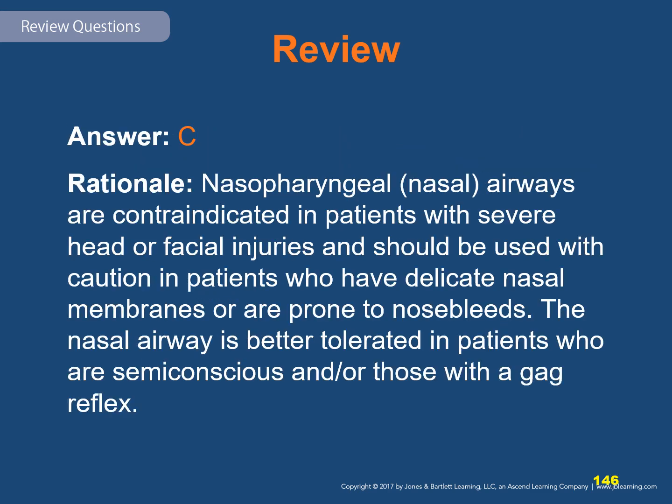The answer is C. Nasopharyngeal or nasal airways are contraindicated in patients with severe head or facial injuries and should be used with caution in patients who have delicate nasal membranes or who are prone to nosebleeds. The nasal airway is better tolerated in patients who are semi-conscious and or those with a gag reflex.